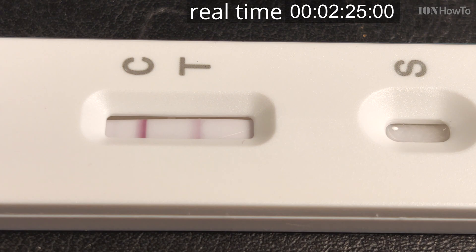After two and a half minutes, the T line is getting more and more clear, and it only gets clearer after this. This is still in real time — 2 minutes 30 seconds.